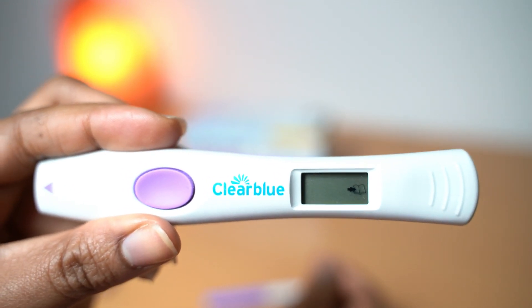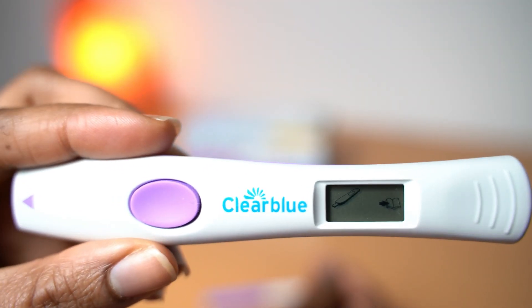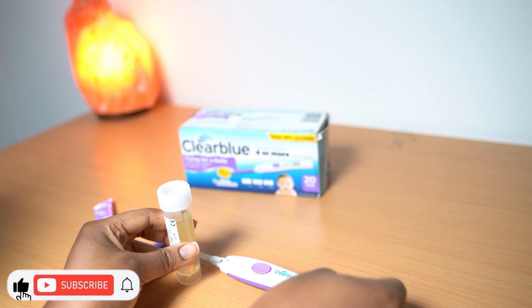So I'm going to do a quick test on how to use this and how to read the results using my urine. This is my urine — I put it down there.